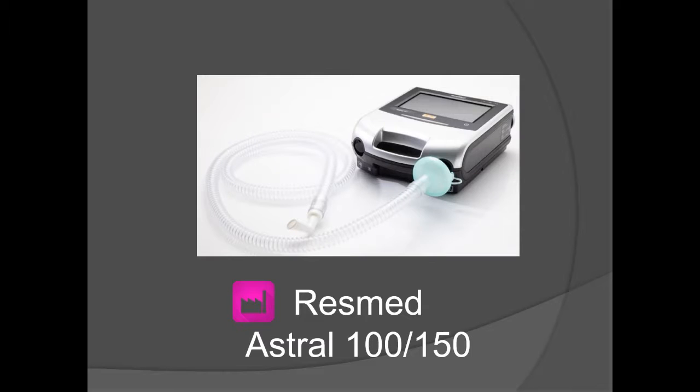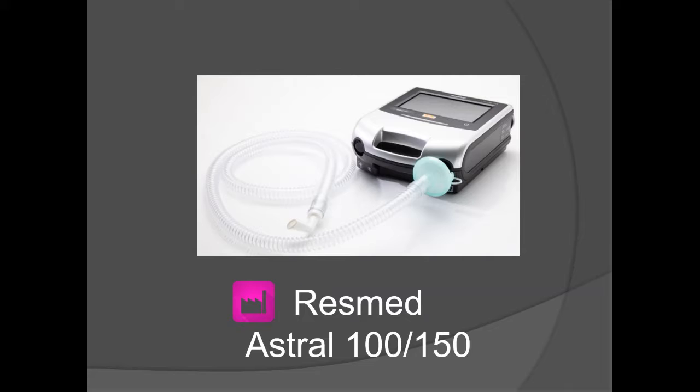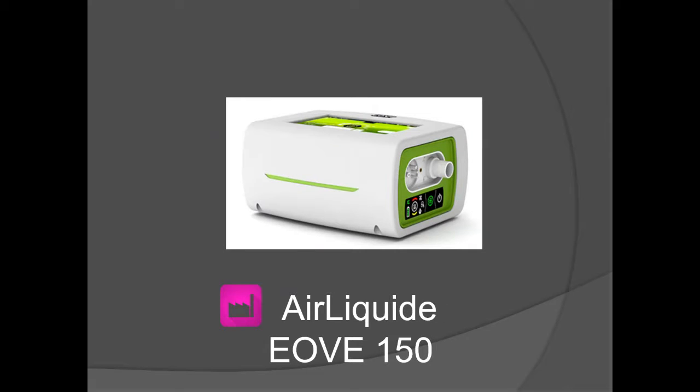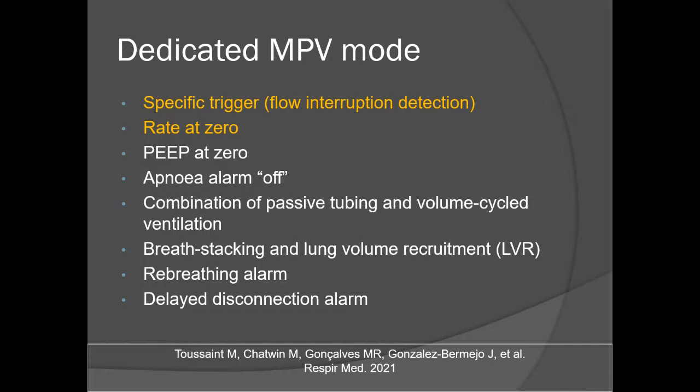But there are other companies like Resmed with the Astral 100 and 150. The Breas Vivo 45 LS and the 55 and the 65. The Lowenstein Luisa. The Air Liquide EOVE 150. The Trace Medical Vox SN. So you can see there are many different devices available on the market. All those devices can support mouthpiece ventilation with more or less of these characteristics.